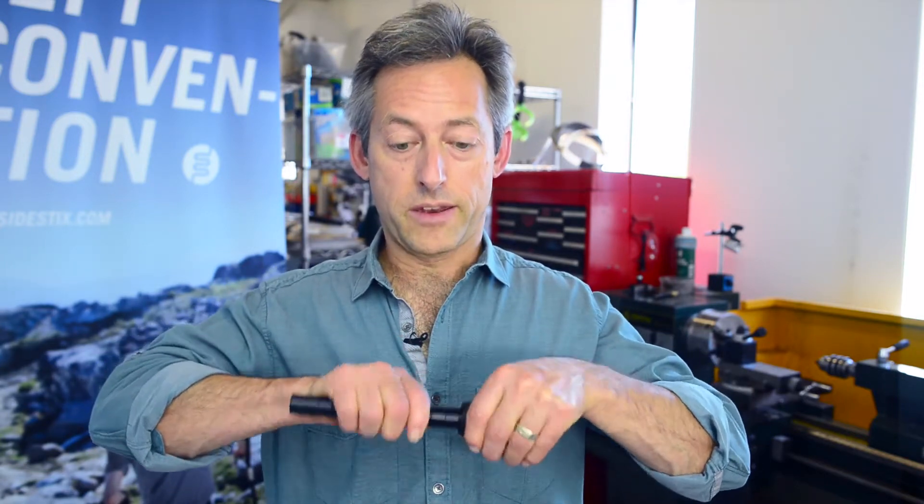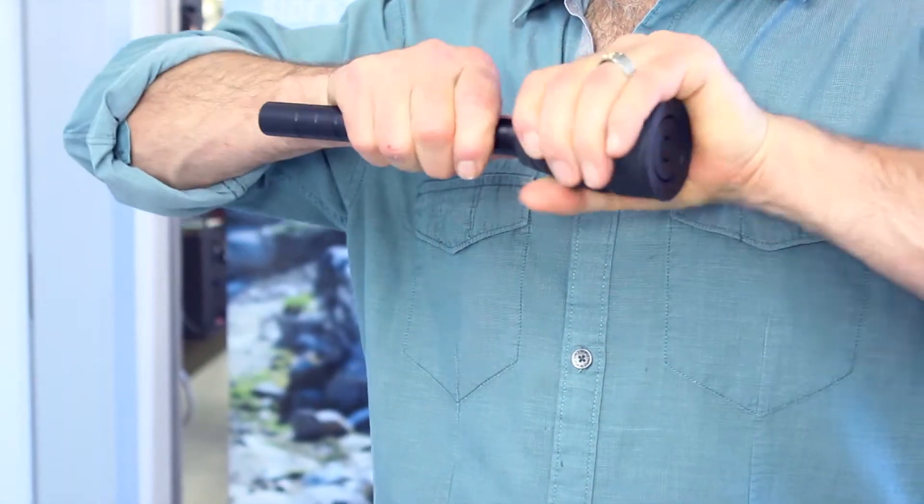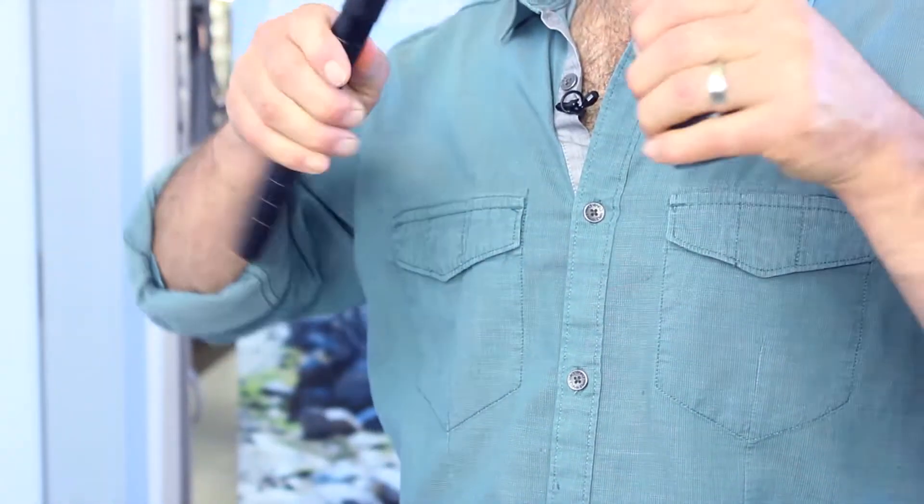You can pull and pull as much as you like and it really won't come off. So the best way of doing it is just to pull gently and bend at the same time. And every time I make a turn, the tip adapter comes out a little bit more. And eventually there it is.